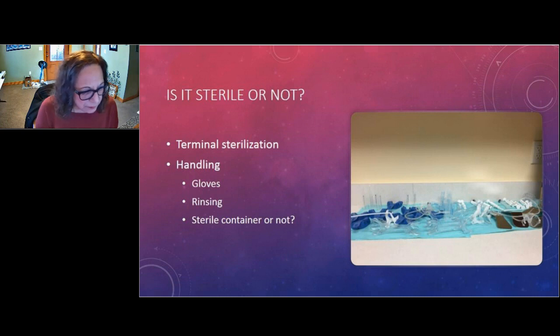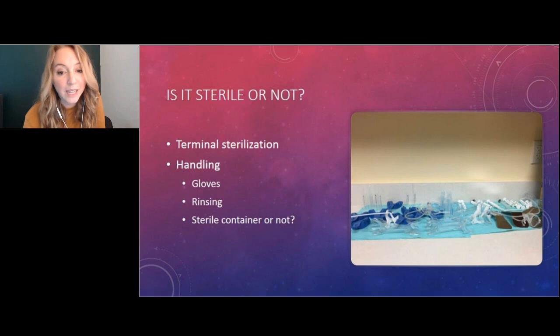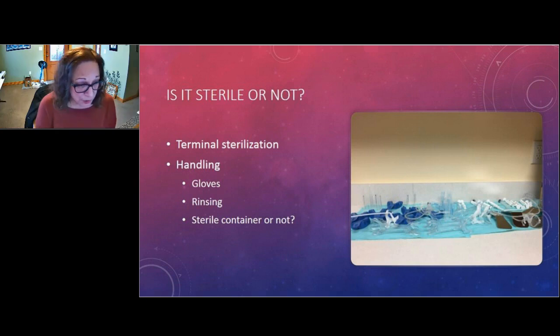I'm not sure I answered that. Sure. So what it says is, it's my understanding that HLD cannot kill spores, but can you explain why dental offices might choose chemicals that require longer soak times instead of, for example, sterilization, when they have such high pressure to turn over instruments quickly? I don't have a good answer for that. When I ask people why you're doing that, or I go to practices and say, well, why are you doing that? The response I usually get is, we've always done it this way.